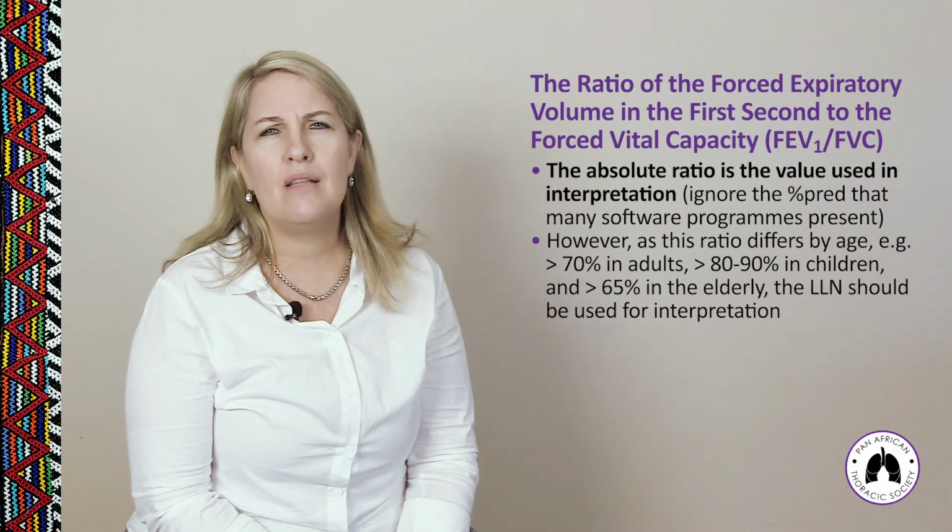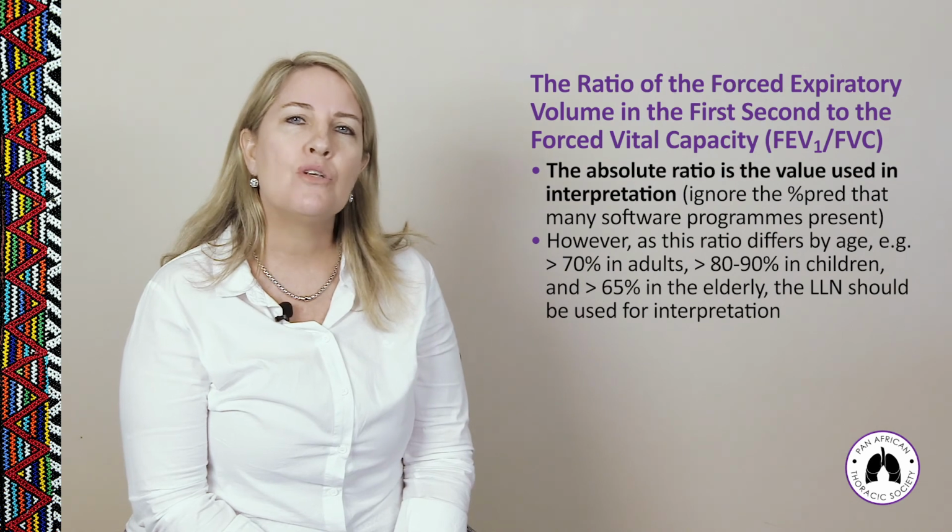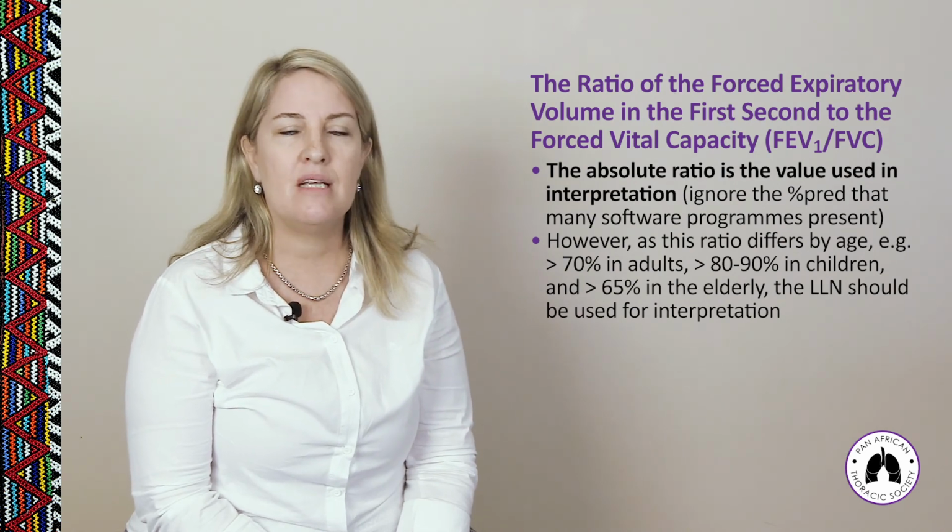So never look at percentage of predicted when looking at the ratio. Always look at the absolute percentage and the Z-score.